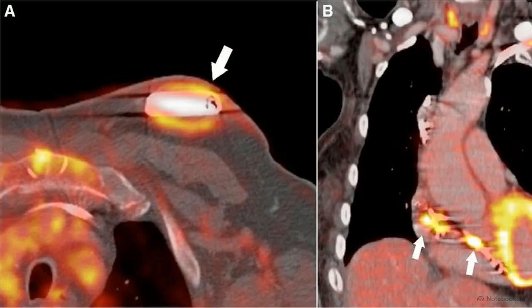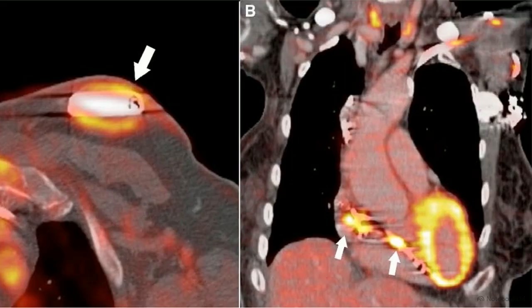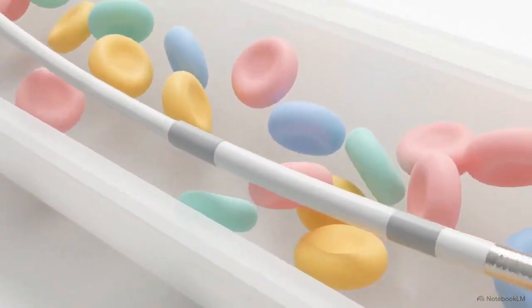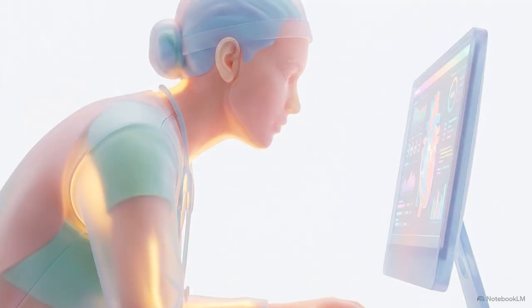Specialists look for focal uptake in specific locations, like the generator pocket in panel A, or along the intracardiac leads in panel B. To improve visualization of these leads, the protocol can be adjusted to a 3-hour delayed acquisition, which allows the background blood signal to fade. Device evaluations require this type of pattern recognition rather than a reliance on automated numerical thresholds.